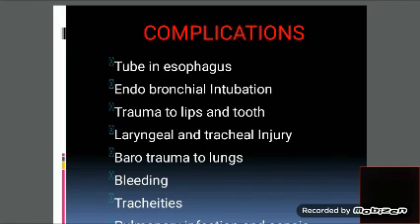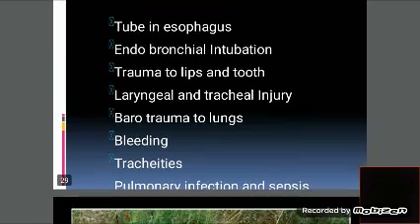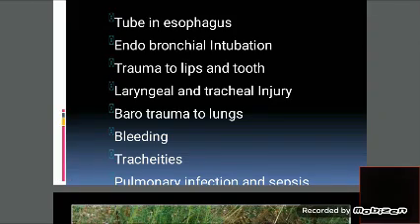Then there will be trauma to the lips and teeth of the patient when there is so much pressure given to the mouth of the patient during intubation. Laryngeal and tracheal injury might occur. Barotrauma to the lungs, that is damage to the lung from rapid lung air pressure. Then there will be tracheitis, that is inflammation of the trachea, and pulmonary infection and sepsis.